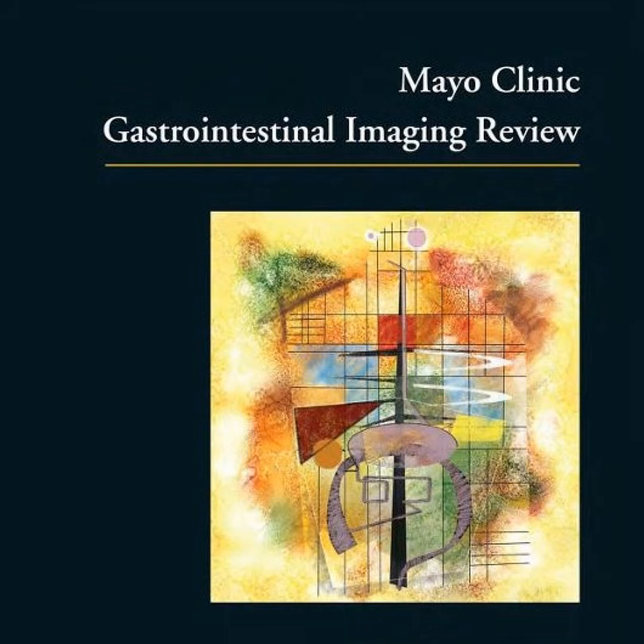A tumor would either displace those vessels, encase them entirely, or show abnormal neoangiogenesis. By tracking the vascular flow, you prove it's just an island of healthy tissue. But the illusions can work in reverse too, which actually brings us all the way back to the scenario we introduced at the very beginning of this deep dive. Right. The patient with colon cancer.